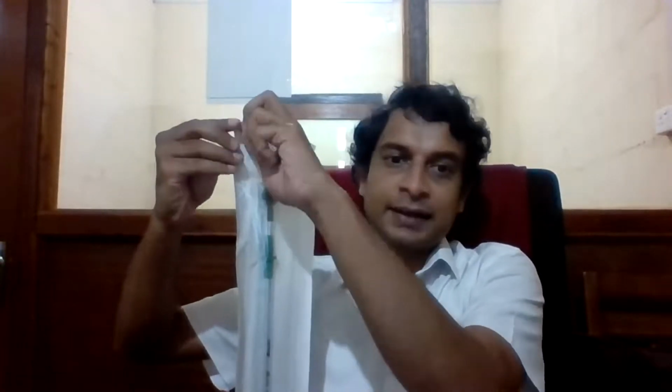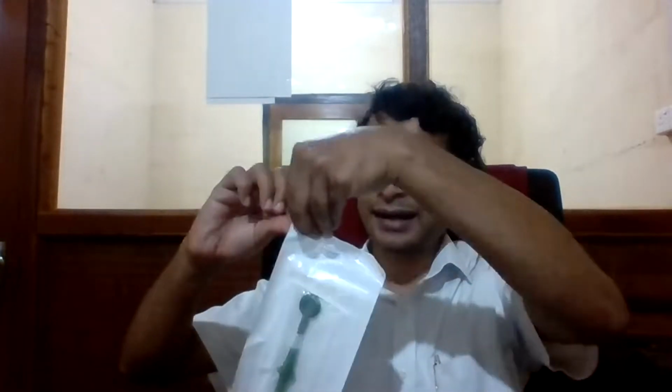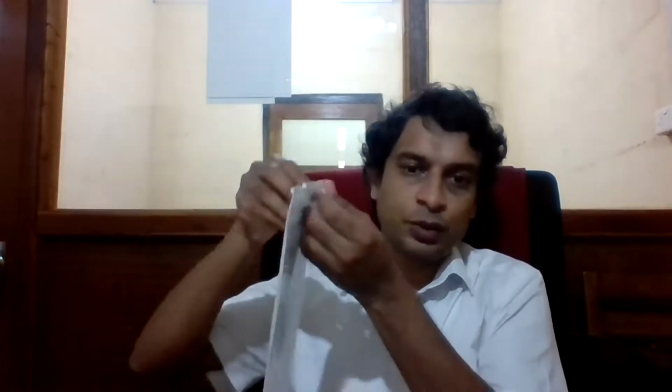These tubes have an outer pack and an inner pack. Usually there's someone who has sterile gloves on, who is waiting for this tube to be sent to you. So you have an outer pack, which is this polythene. You just open it up like that. The inner pack comes like that. You just fold like that and you give the person there the inner pack. And when it's sterile, the person wearing the sterile gloves will take out the inner pack by themselves.